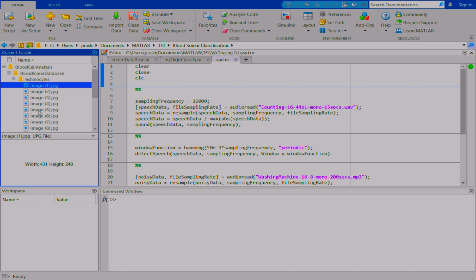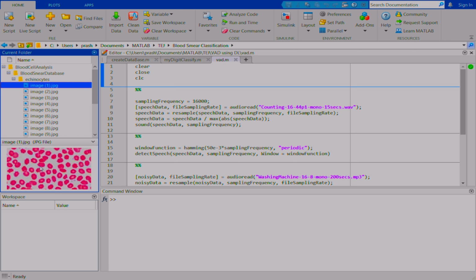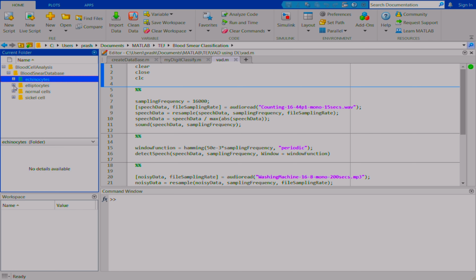I'll show you the image. You can see here on the left hand side, the image says that the blood cells don't have a proper shape. You can see that they have some edges. It's not a smooth edge, right? So look carefully. I'm going to show this later, but just now I want to show you the various classes of data we have.